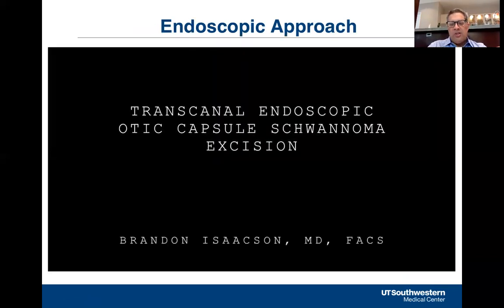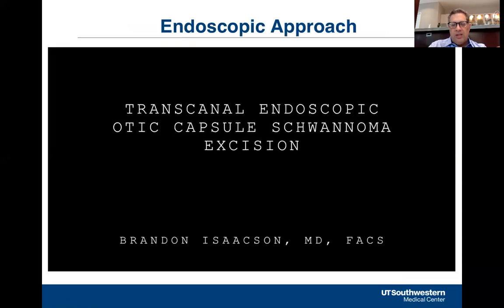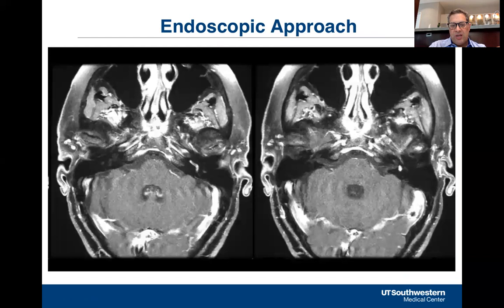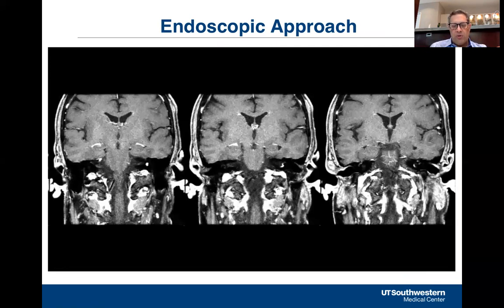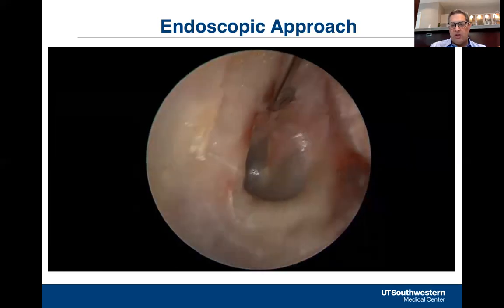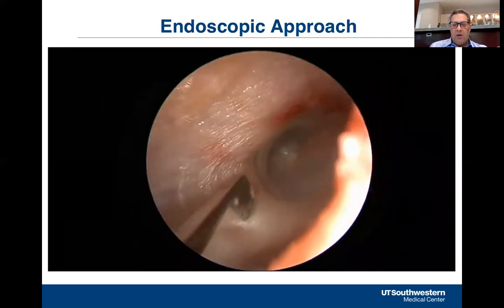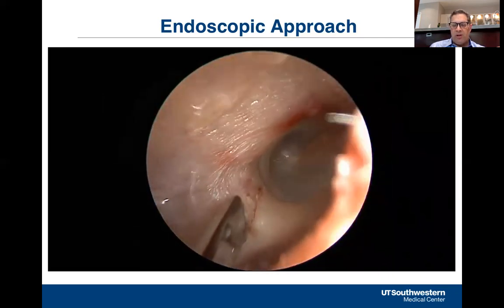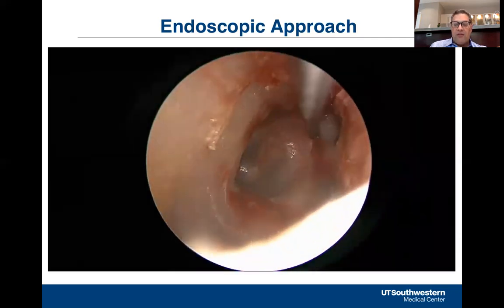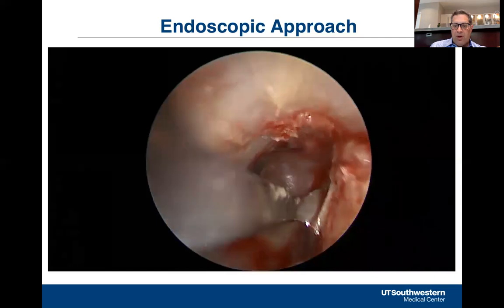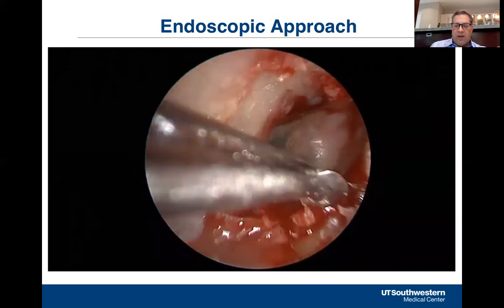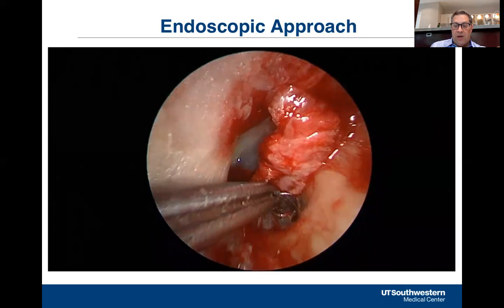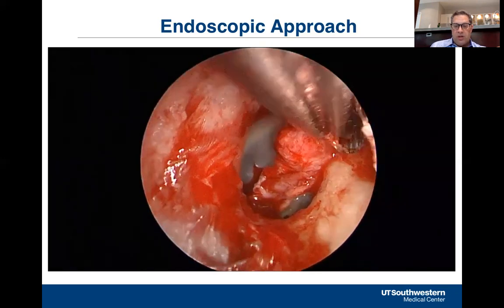This is an example using an endoscopic approach. I'll go into further detail about when I use an endoscope versus a microscope. This patient had an intracochlear and intravestibular tumor, had significant vertigo, and elected to have the tumor removed via this approach. She had Meniere's-like symptoms intractable to medications and gentamicin, so we elected to perform this approach endoscopically. We're doing a traditional tympanomeatal flap — this shows making canal incisions — and we're going to do this entirely via a simple transcanal approach.